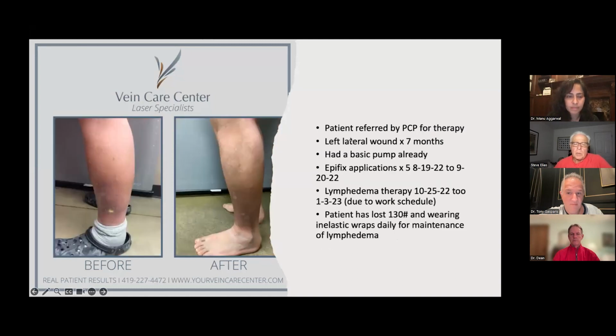So Manu, just a couple of things for the people that are listening from a practical viewpoint. You just inferred one of the questions I was going to ask you. So you start pump therapy. First of all, what expectations do you say to the patient? In other words, the patient is going to say, "Oh, I'm going to use it for 4 days, and my leg's going to look like normal again." Or, what do you tell them? It takes X number of weeks to see an improvement, and then we want to see you back after those X number of weeks to see how you're doing, if we need to modify things or anything.